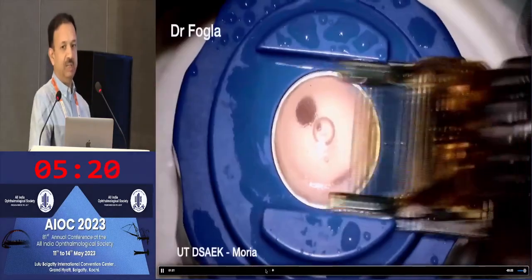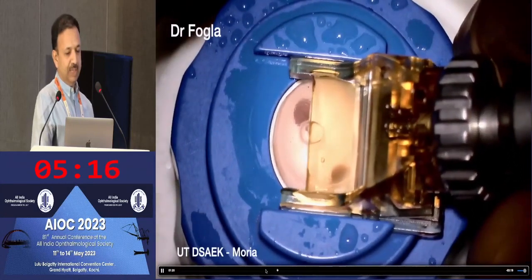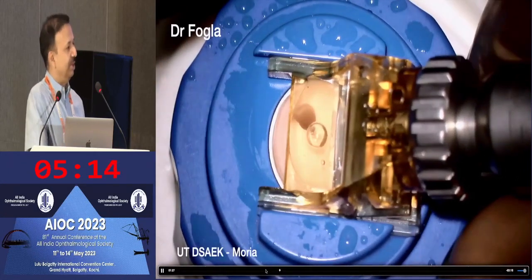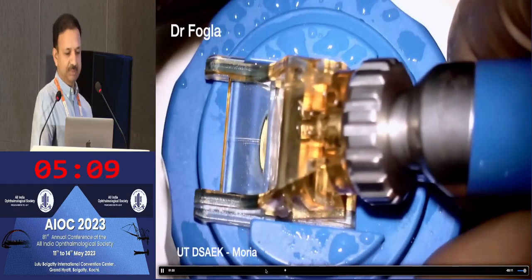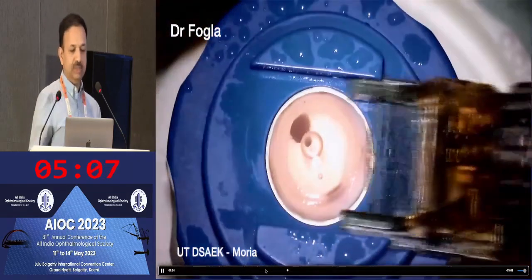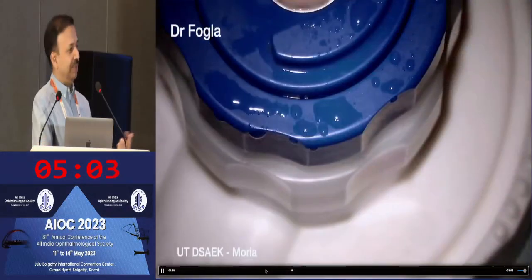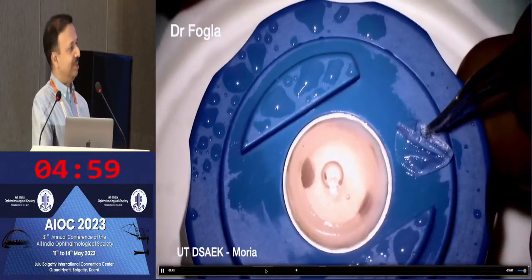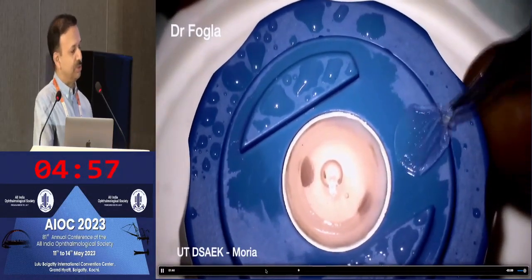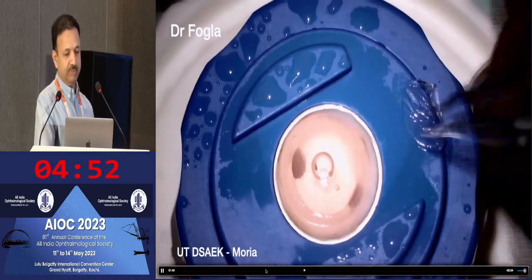There is a nomogram with which you can proceed. I'm using a 90-micron head for the second pass. Ideally, from 210 microns, using a 90-micron head, you should be left with about a 120-micron thickness lenticule. We rotate the graft to make the second pass from the opposite side, because the initial cut depth is a little deeper and becomes more superficial going to the opposite end — so you reverse to avoid perforation.